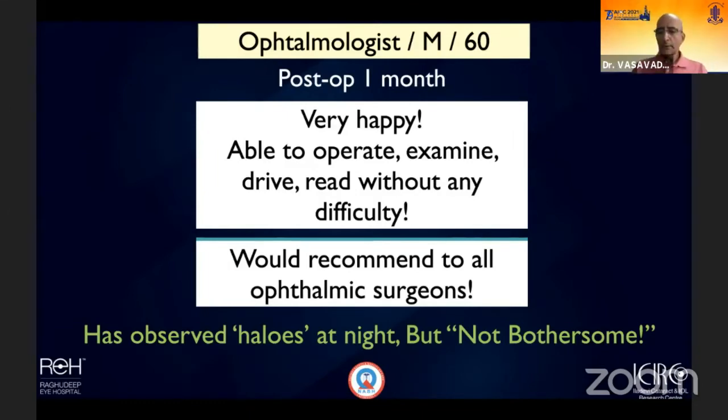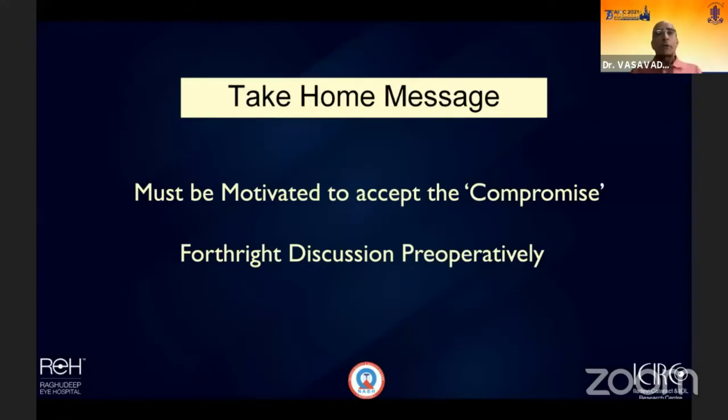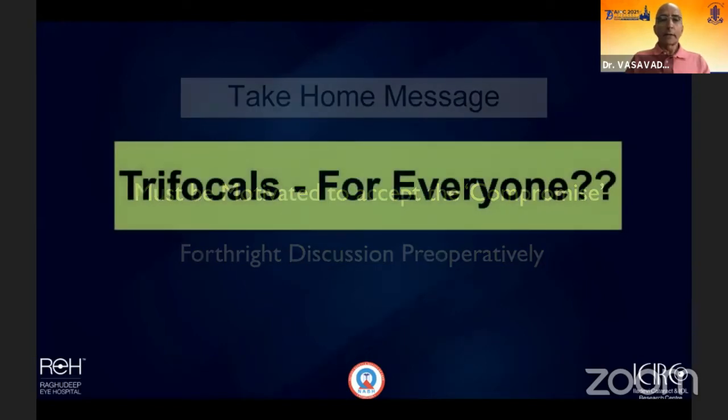And it's really not a big thing. So if you are motivated to compromise with halos at times, or use extra light at times, or some reading aids at times, you can improve your lifestyle and consider the PanOptix lens at the time.